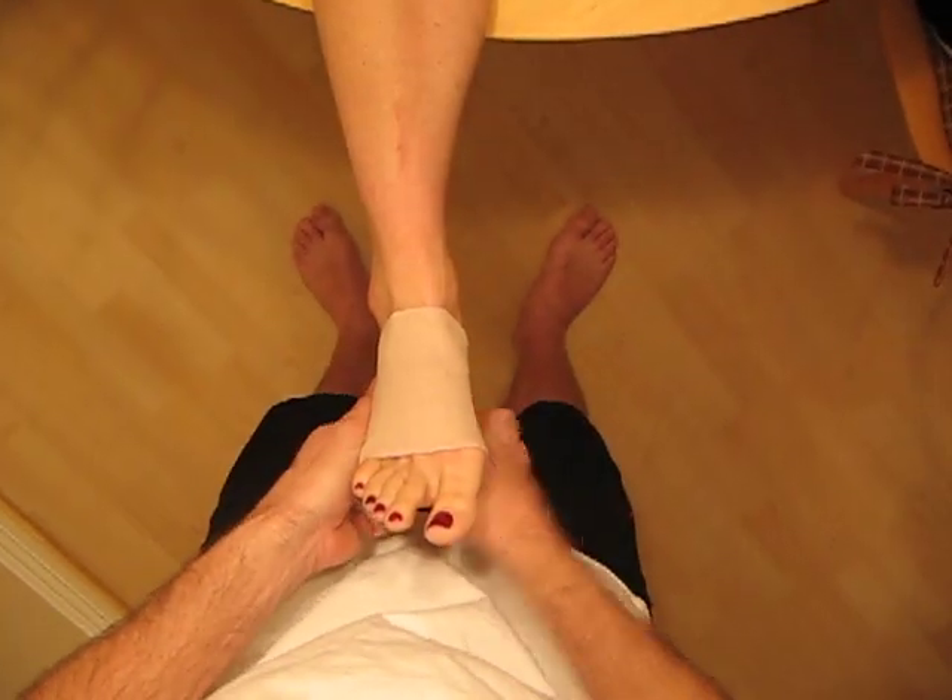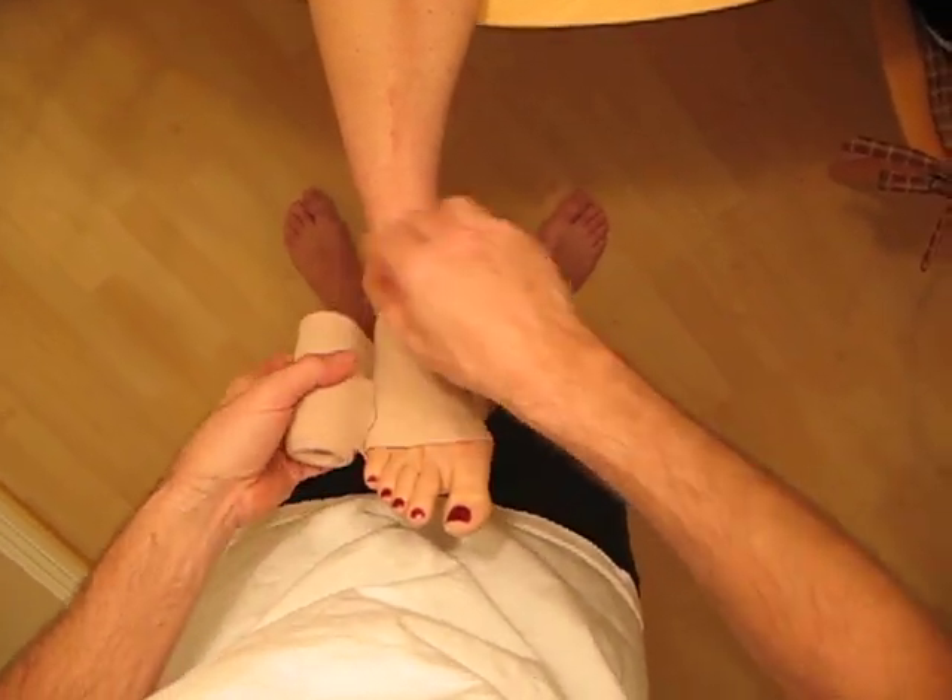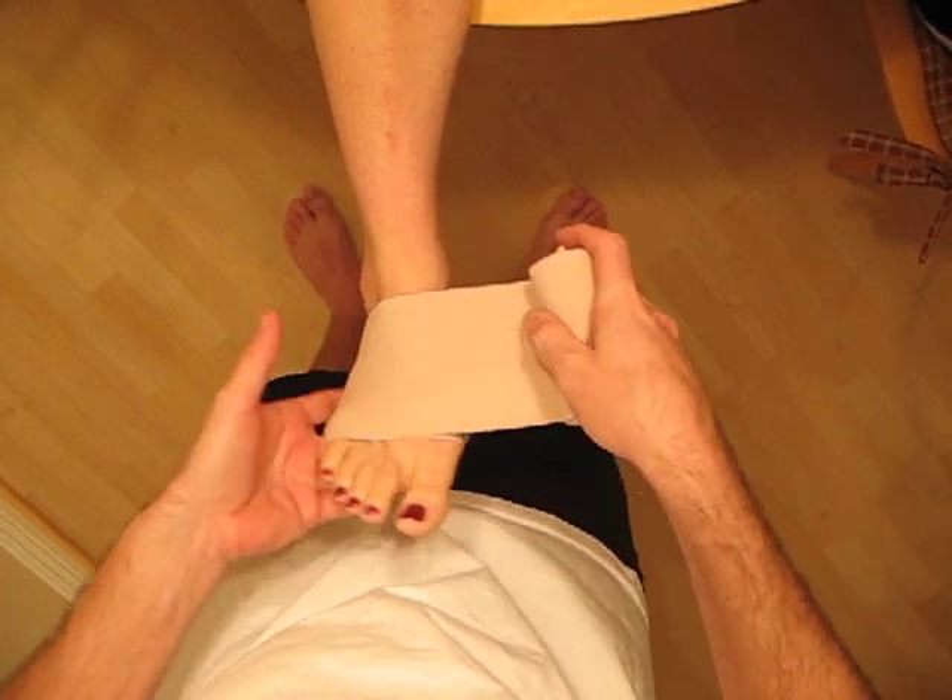You can start right over the foot, get our anchor down all the way around one time, keep our foot up in neutral.